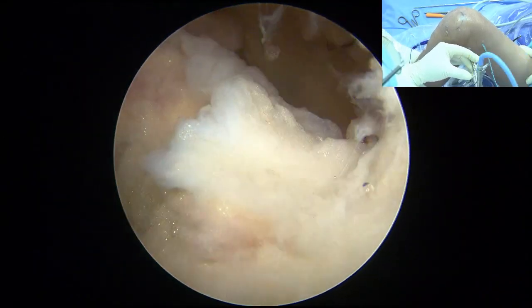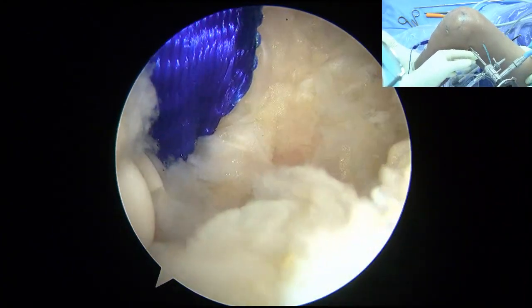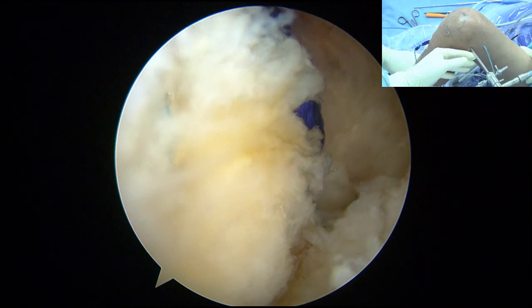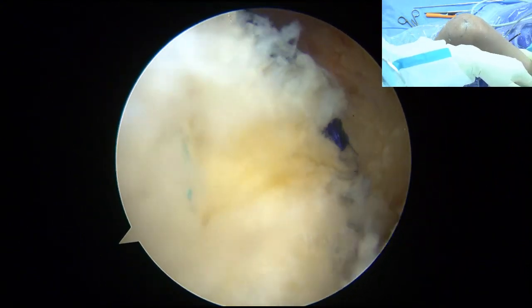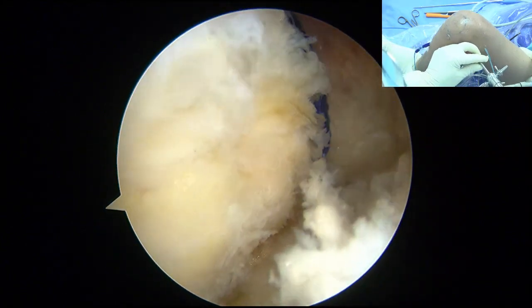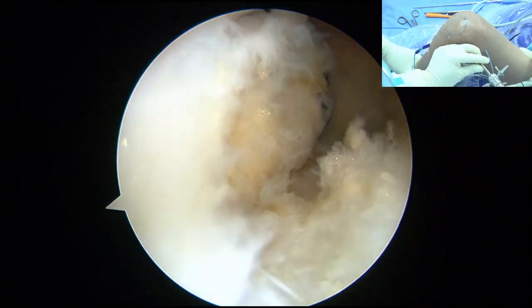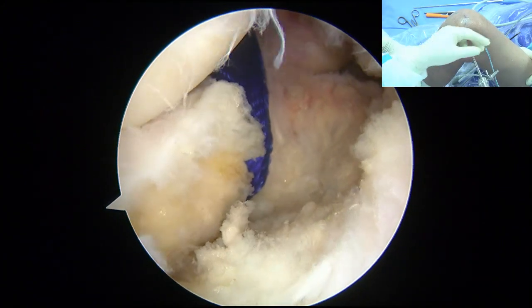Okay, that just showed from me, PCL, right? The screw, PCL. Okay, you can see here, fixing, right? Here, yeah, it's fixing to, you can see here, the anchor is there, okay? Yeah, anchor is there. Okay. Good. Okay, some we cannot see very well. Sometimes we get stuck somewhere, okay? Good. Okay.